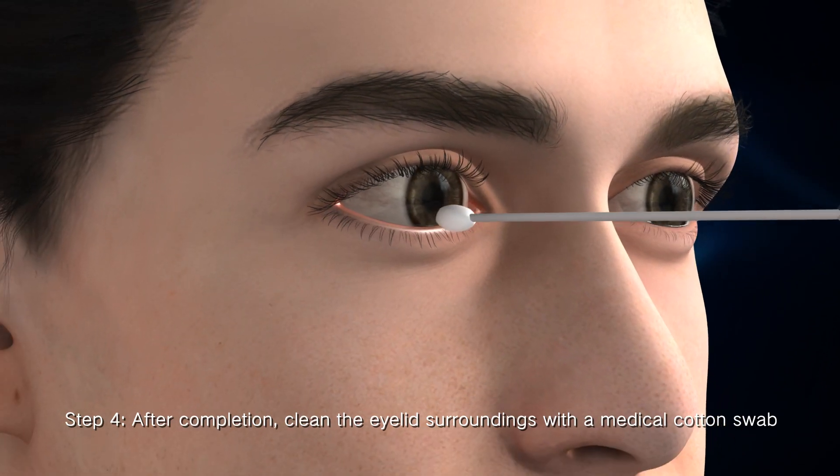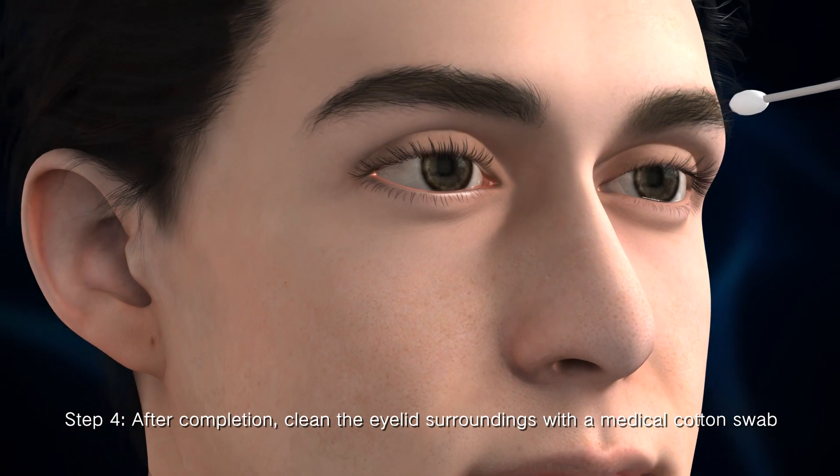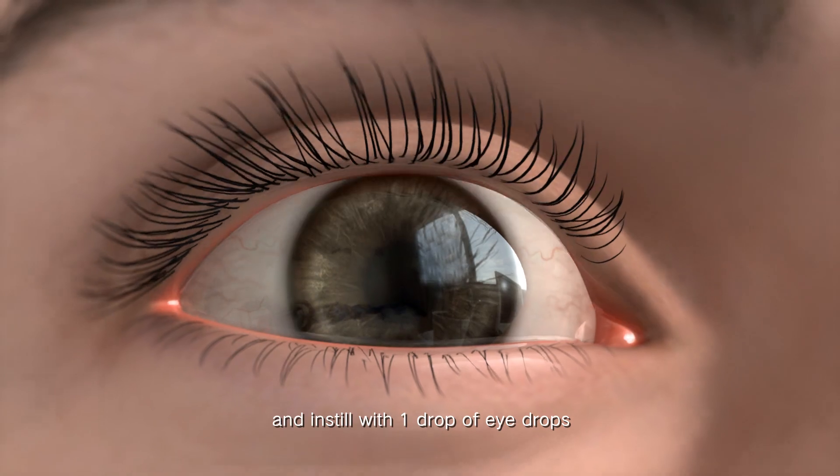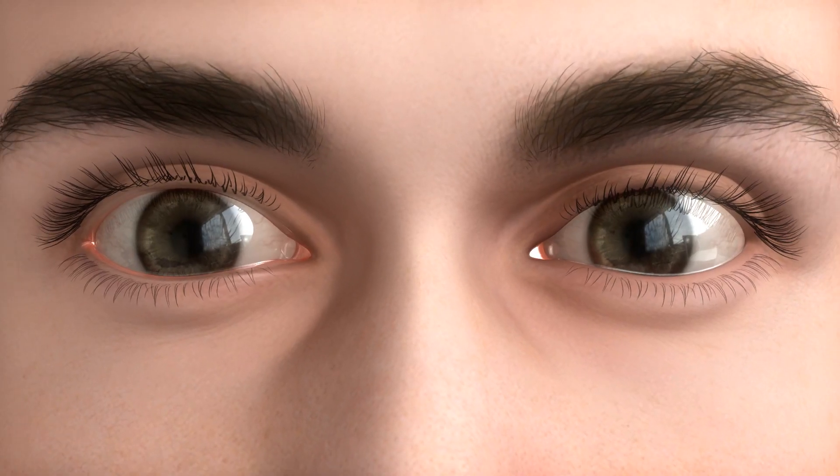Step 4: After completion, clean the eyelid surroundings with a medical cotton swab and instill one drop of eye drops.